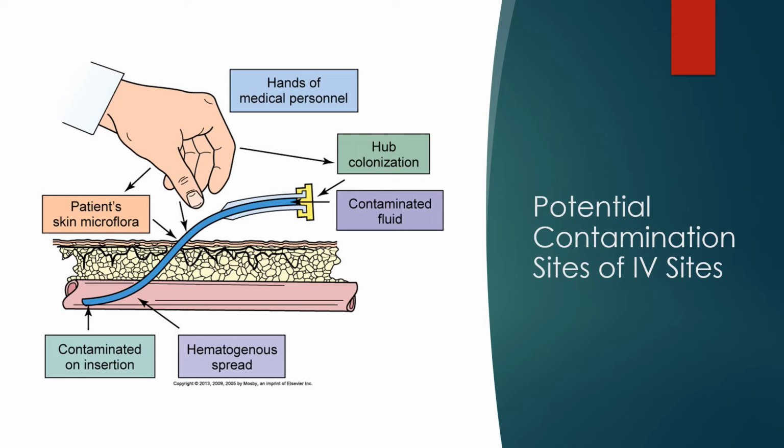So this picture shows a little bit better what we're talking about, all the things that can cause risk. If we start at the bottom, contamination during insertion: anything you do from not scrubbing the site, to touching the site after scrubbing it, to not wearing gloves or even tearing. Sometimes you'll see older nurses tear that finger out of the glove for better access. That's really just contaminating your site. So if you contaminate your site, you put your needle in, you have a contaminated needle, and now you've just put that contamination into your patient.